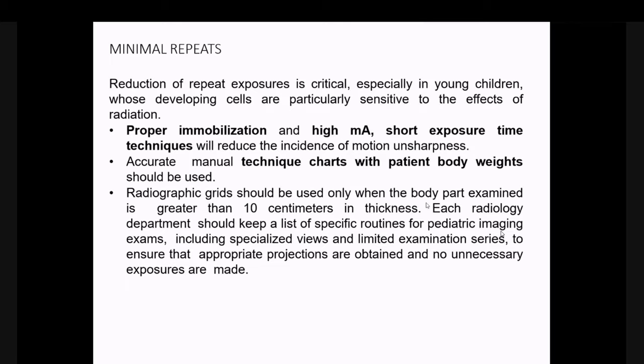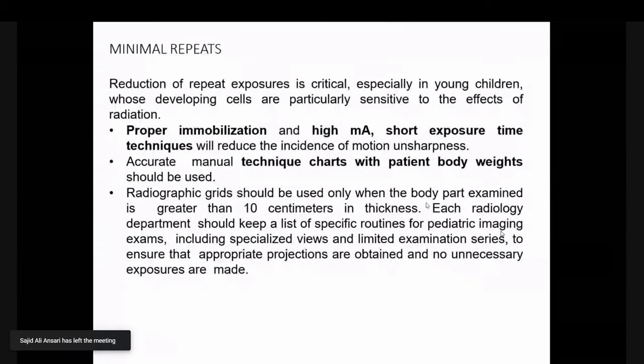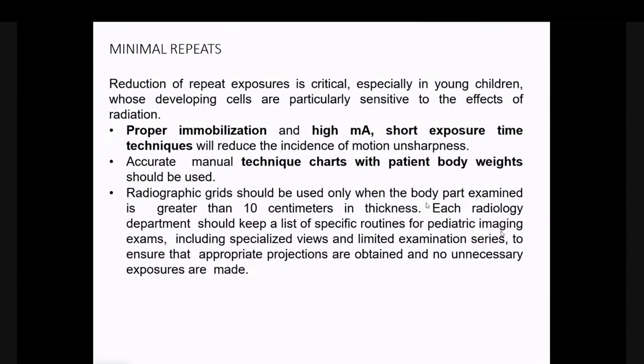So this is the most important topic that radiographers must be aware of: that they do not repeat children's radiographic exams. Because if we are using a better technique and proper immobilization devices, there is very little chance that we need to repeat the examination. But definitely this comes with experience. We cannot assume that a newly qualified radiographer can acquire pediatric radiographs as easily as an experienced one. Definitely this comes with experience.